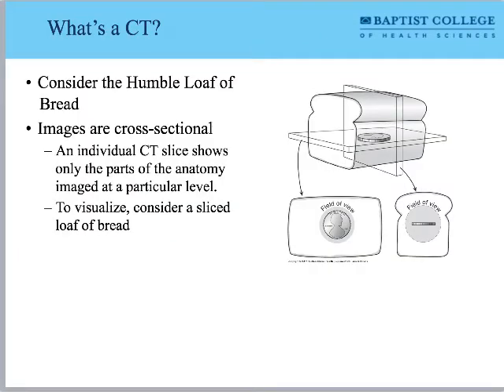So I say all that to say, the reason I'm interested in that, I don't necessarily need you to know those names. Knowing 1971 is helpful, right? That is helpful to know that early 1970s is when CT broke out into medical use, right? But I want you to know that everything moving forward now, as we look at where will CT be 5 years from now, 10 years from now, it is going to look a lot like what just happened.